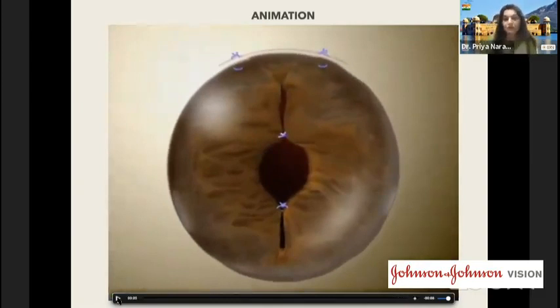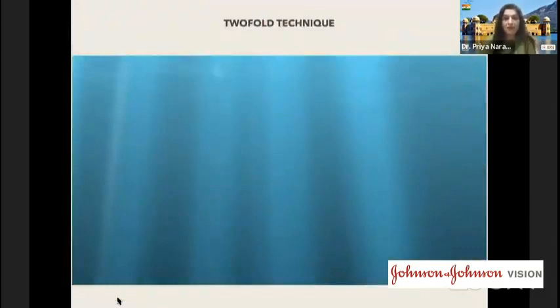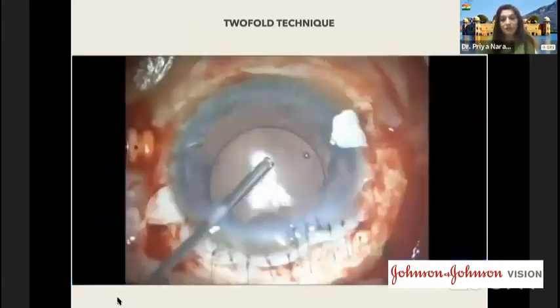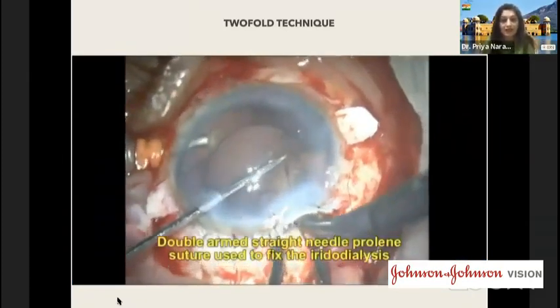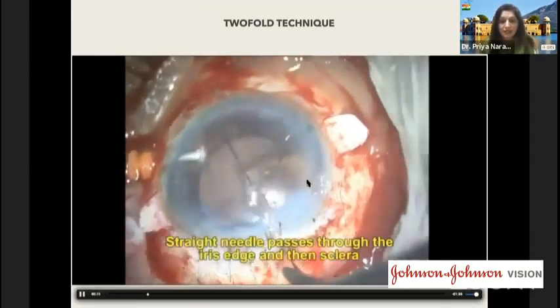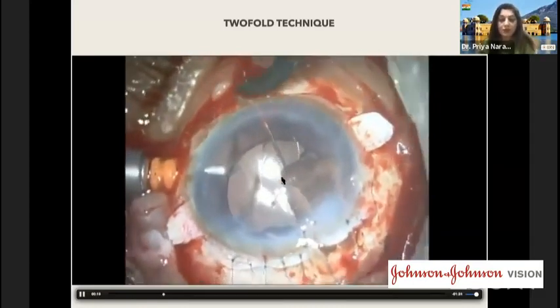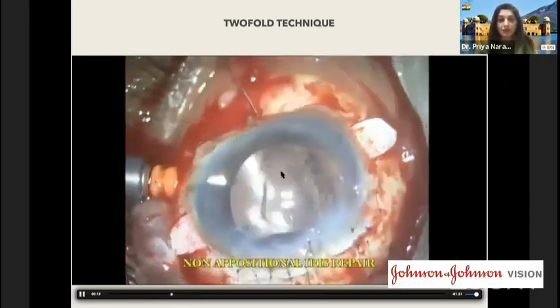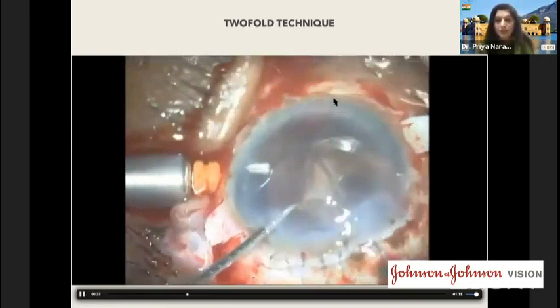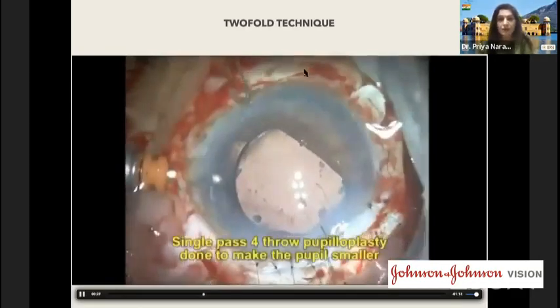So going from this to the clinical video that I'll just try to show you. This is a case of a traumatic iridodialysis. There's a maximum of more than 270 degrees of iridodialysis that you see here. So you're just trying to deposit this iris tissue inside. You can see the entire iris tissue is totally fragile, and it is barely possible to do this. But with a lot of patience and grit, when you try to go ahead with this and deposit this iris tissue out here, you create a scleral groove, try to pass through the periphery, come up, and tie it up into the scleral groove where you have done this.